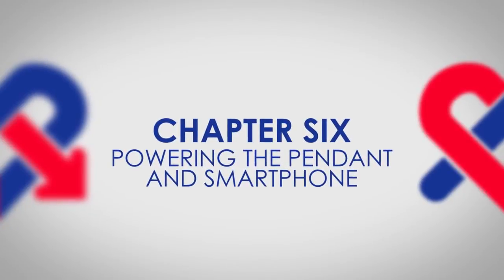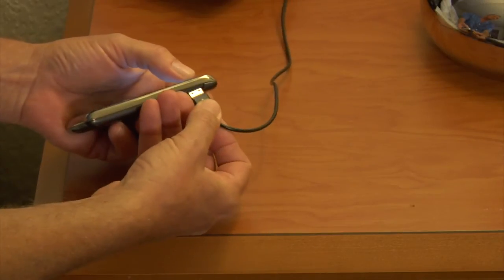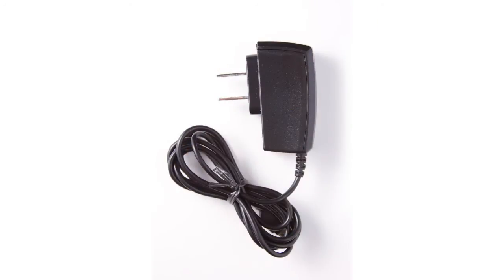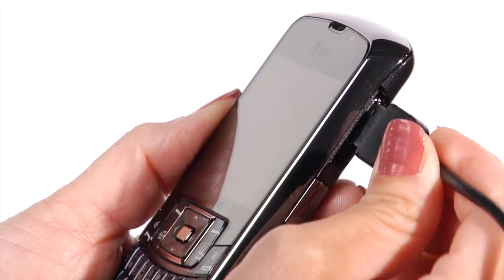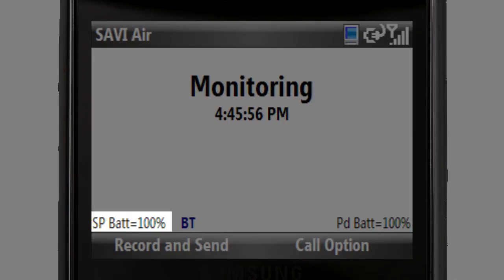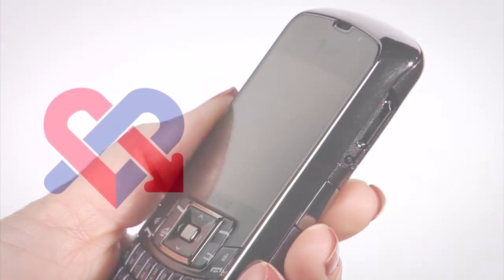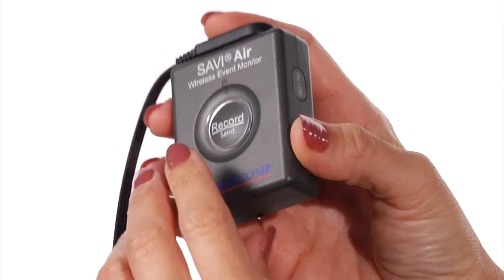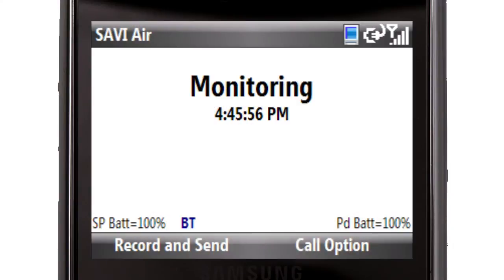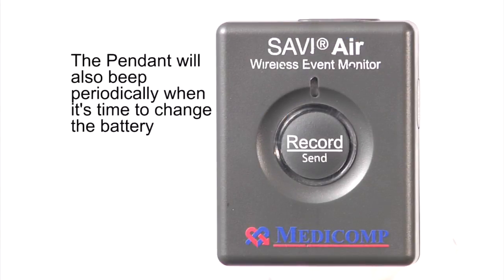Powering the pendant and smartphone. Charging the smartphone: be sure to charge the smartphone daily. Charging it overnight should ensure enough battery power to last an entire day. Connect one end of the charger to the smartphone and the other to a wall power outlet. You will see a battery indicator on the screen. Once fully charged, disconnect the cable. Pendant battery: the pendant uses one AA alkaline battery that needs to be replaced periodically. The smartphone will alert you when the pendant's battery needs to be changed. The pendant will also beep periodically when it's time to change the battery.